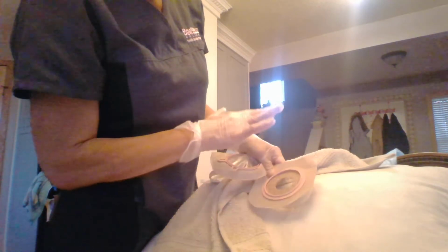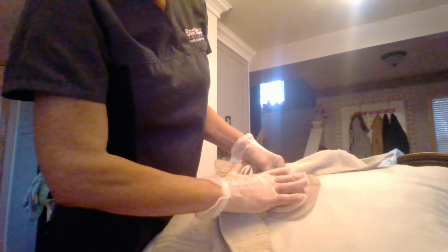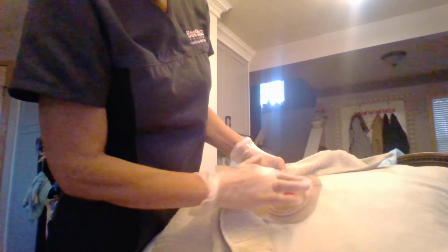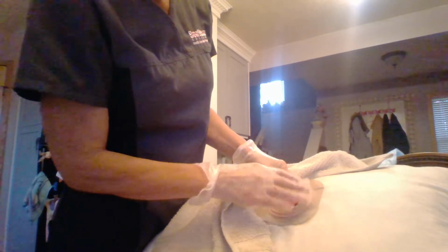This one is, once you remove the backing, you hold it, press gently down, make sure the system is all with no wrinkles, and slightly pressing down around it to help create a really good seal.